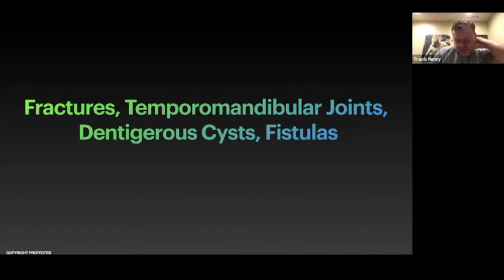So generally, we're pretty conservative with how we treat that. We're first dealing with the sinus. If we have the conchal bulla involved, we'll clean them out as well. But then we use long instrumentation, the scope generally, and sprays such as phenylephrine sprays, or now there are these long syringes that we can inject lidocaine with epinephrine in to help control bleeding as well.